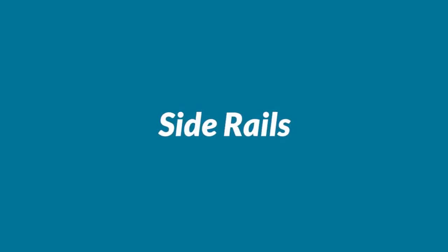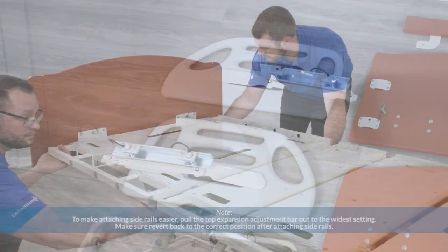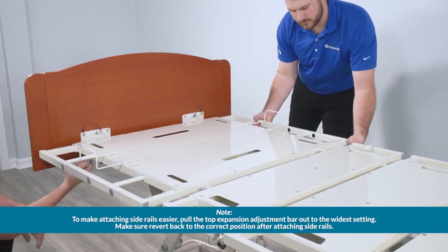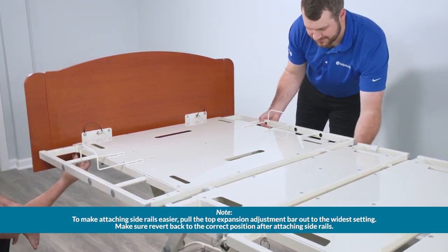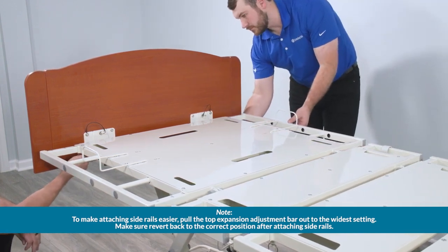Slide rails. Lastly, we can attach the side rails. To make attaching side rails easier, pull the top expansion adjustment bar out to the widest setting. Make sure to revert back to the correct position after attaching side rails.